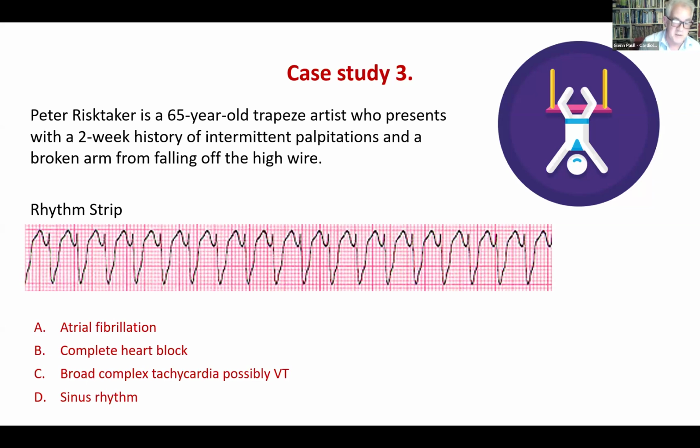The algorithms on the ECG machines are good, but they're certainly not infallible. But certainly if they say it's an infarct, it will have detected the ST segment elevation. And whilst it may not be an infarct, they certainly should be taken seriously and be followed up by someone in person.